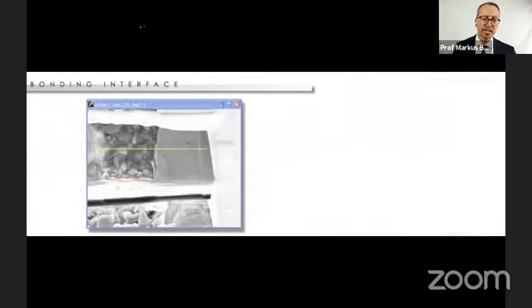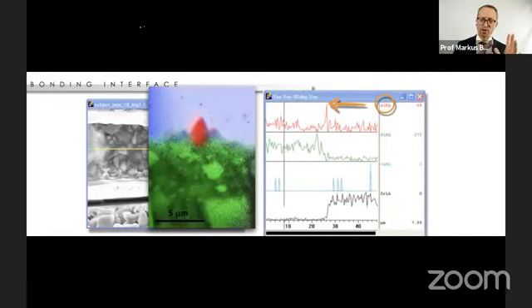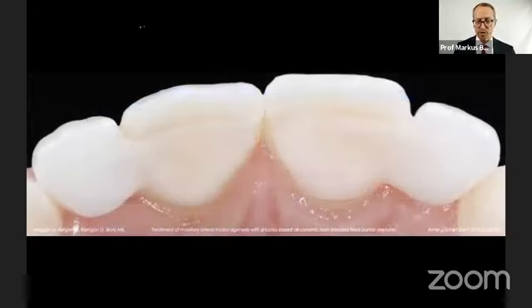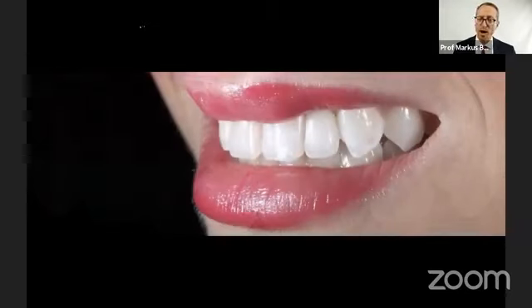And what you could see is actually that it's not just a roughening effect, because it's not like acid etching of a silica-based ceramic. It's more that you have these particles, and that's the interesting part, slightly roughening the surface, but also having these particles embedded into the surface. By doing so, they're now available for bonding with this primer, the special primer for zirconia, and then you can get these high bond strengths and make these restorations last, as you can see, 10, 15 years in almost 90% success rates of the cases, if you know how to do it properly.